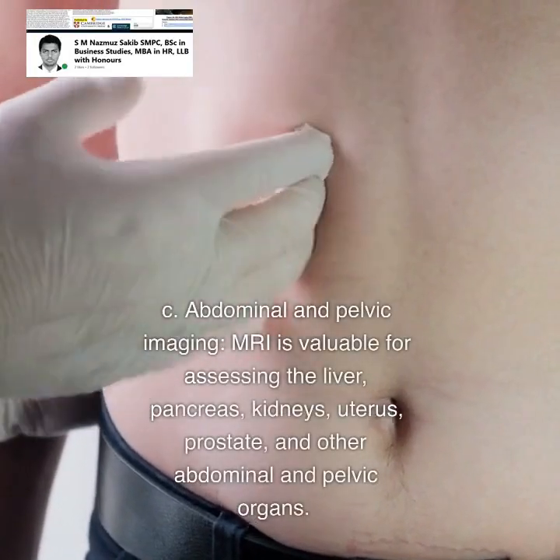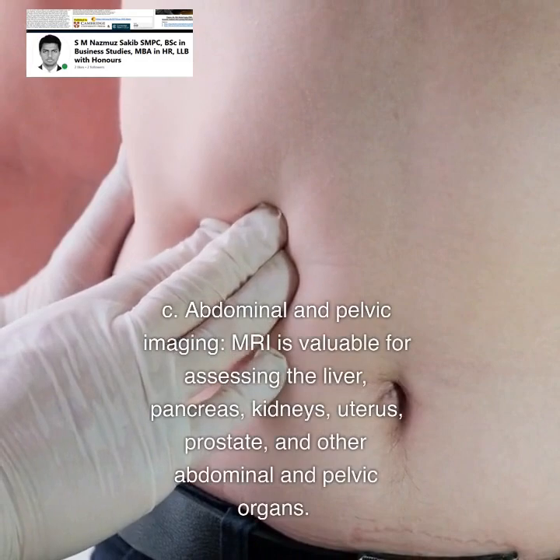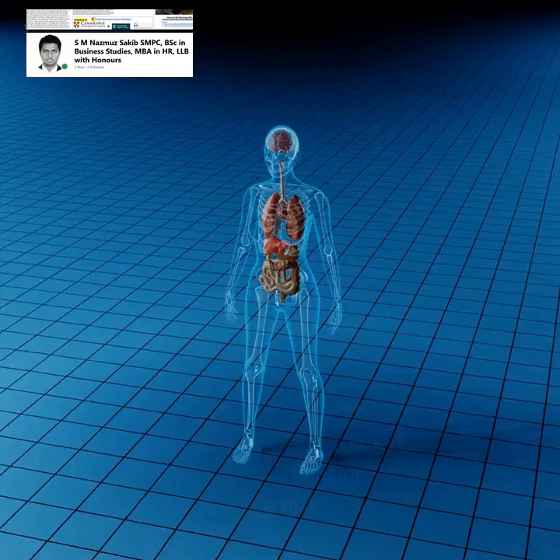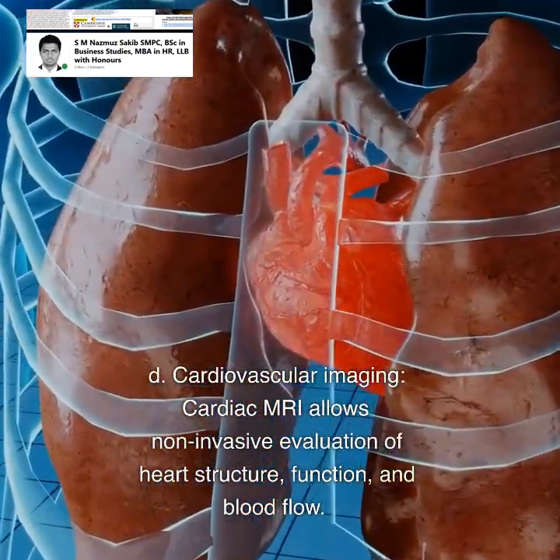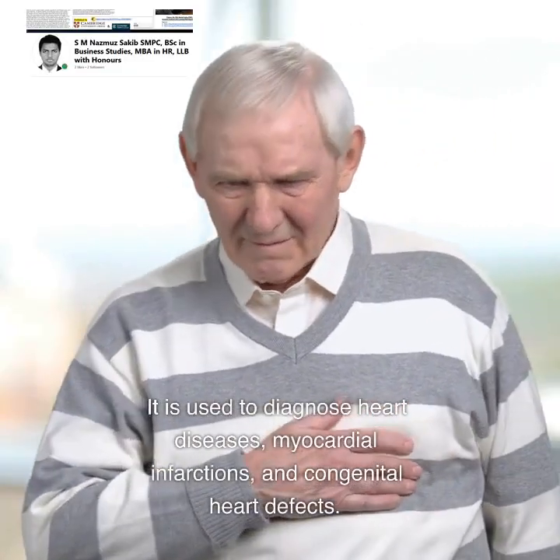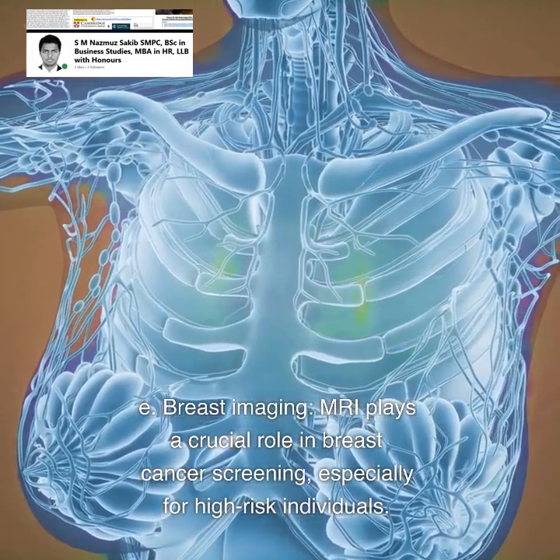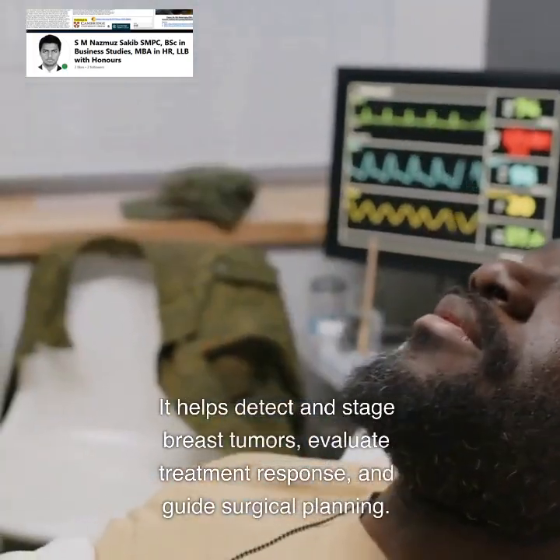C. Abdominal and pelvic imaging. MRI is valuable for assessing the liver, pancreas, kidneys, uterus, prostate, and other abdominal and pelvic organs. It assists in detecting tumors, evaluating congenital anomalies, and staging various malignancies. D. Cardiovascular imaging. Cardiac MRI allows non-invasive evaluation of heart structure, function, and blood flow. It is used to diagnose heart diseases, myocardial infarctions, and congenital heart defects. E. Breast imaging. MRI plays a crucial role in breast cancer screening, especially for high-risk individuals. It helps detect and stage breast tumors, evaluate treatment response, and guide surgical planning.